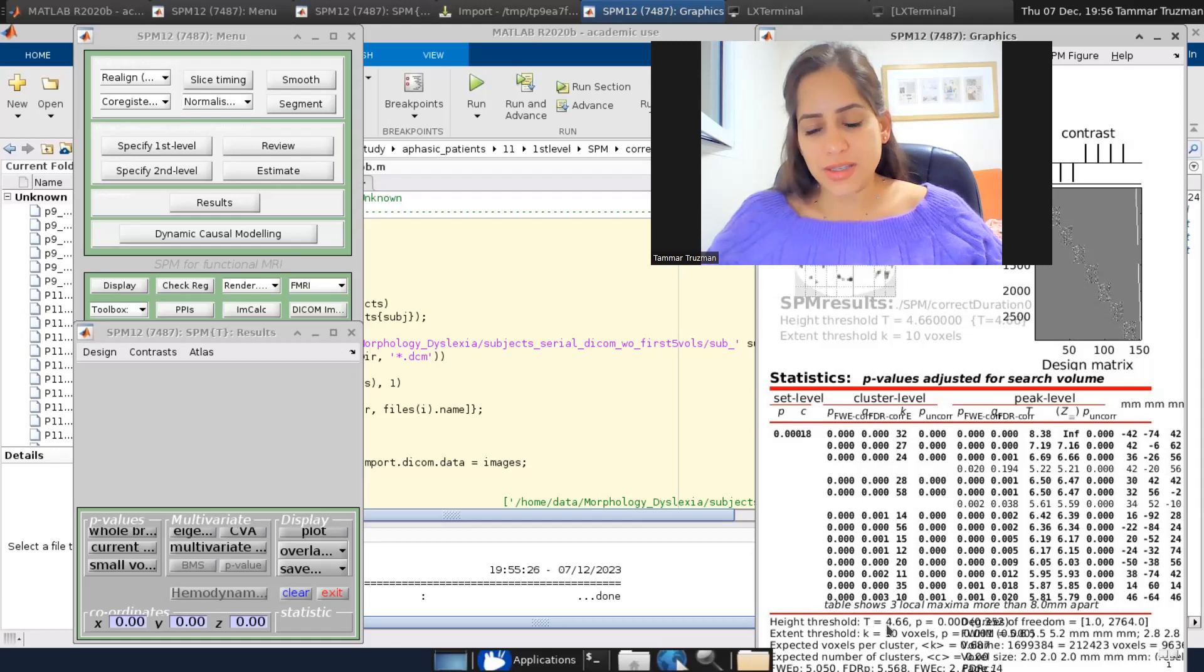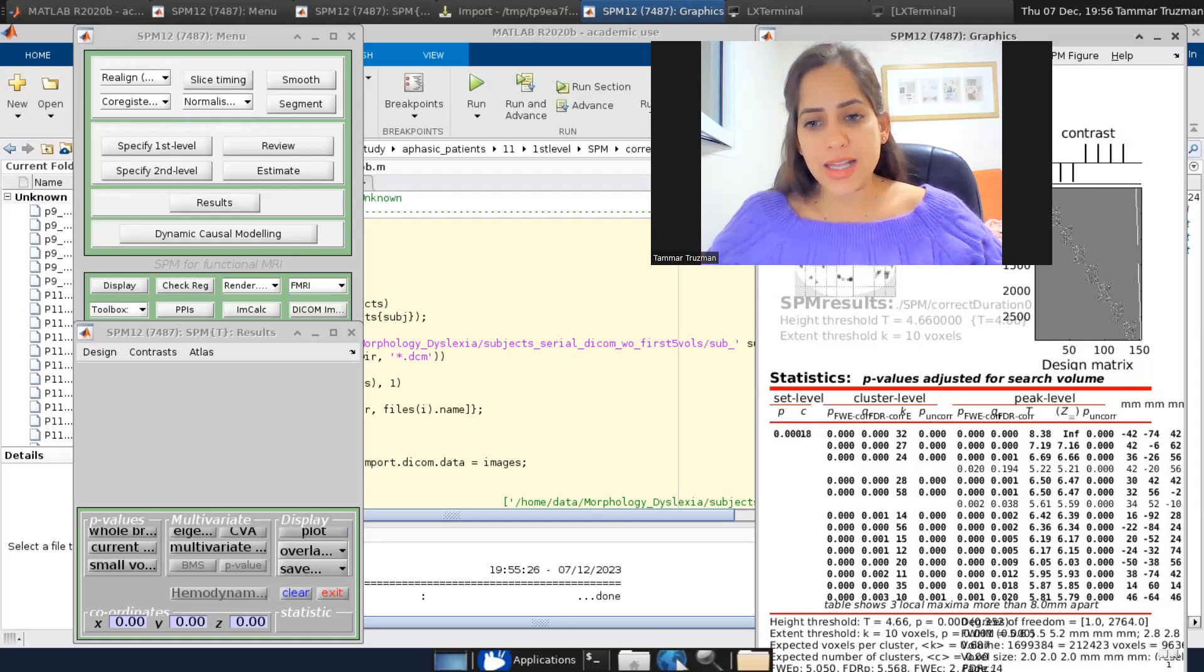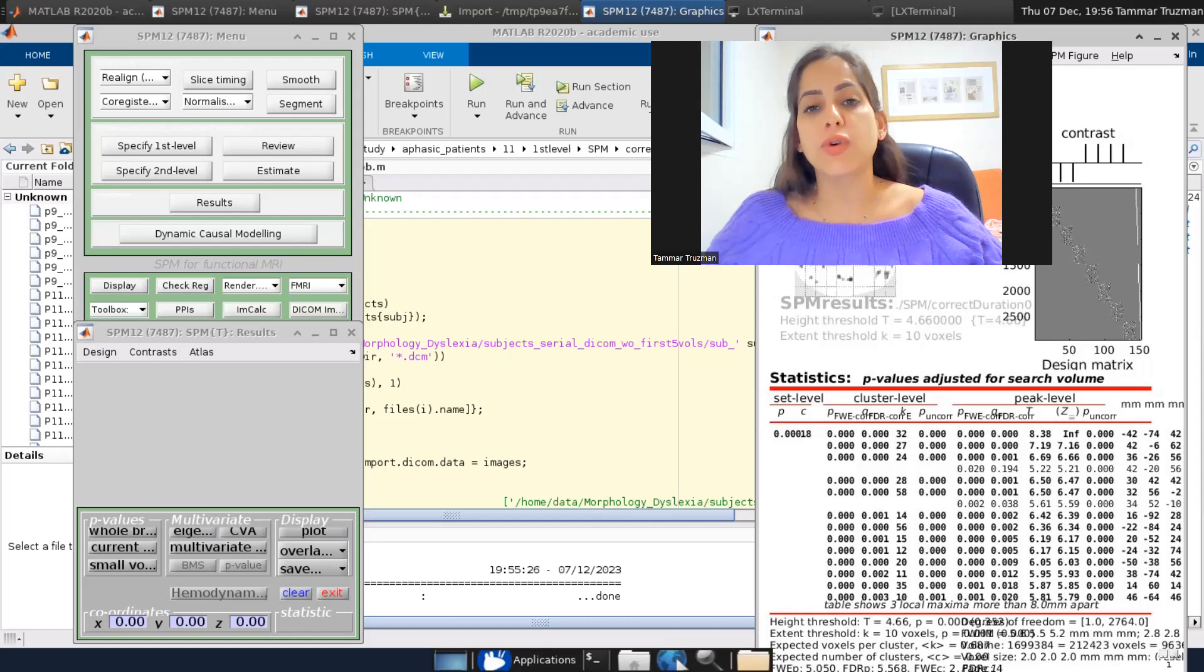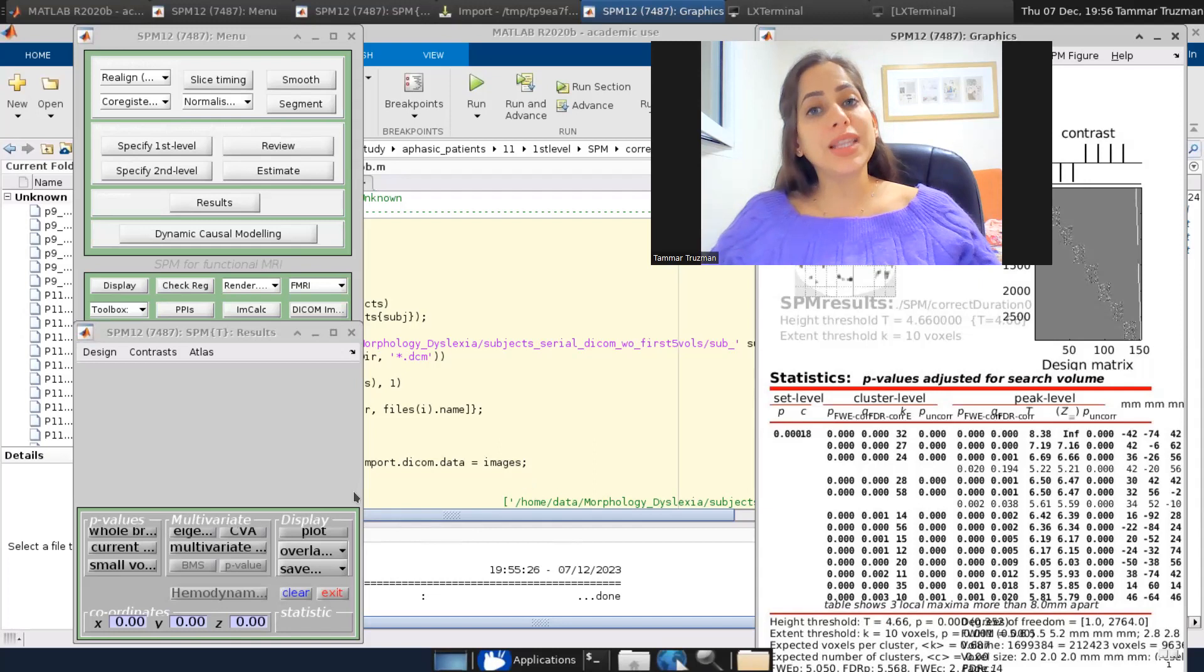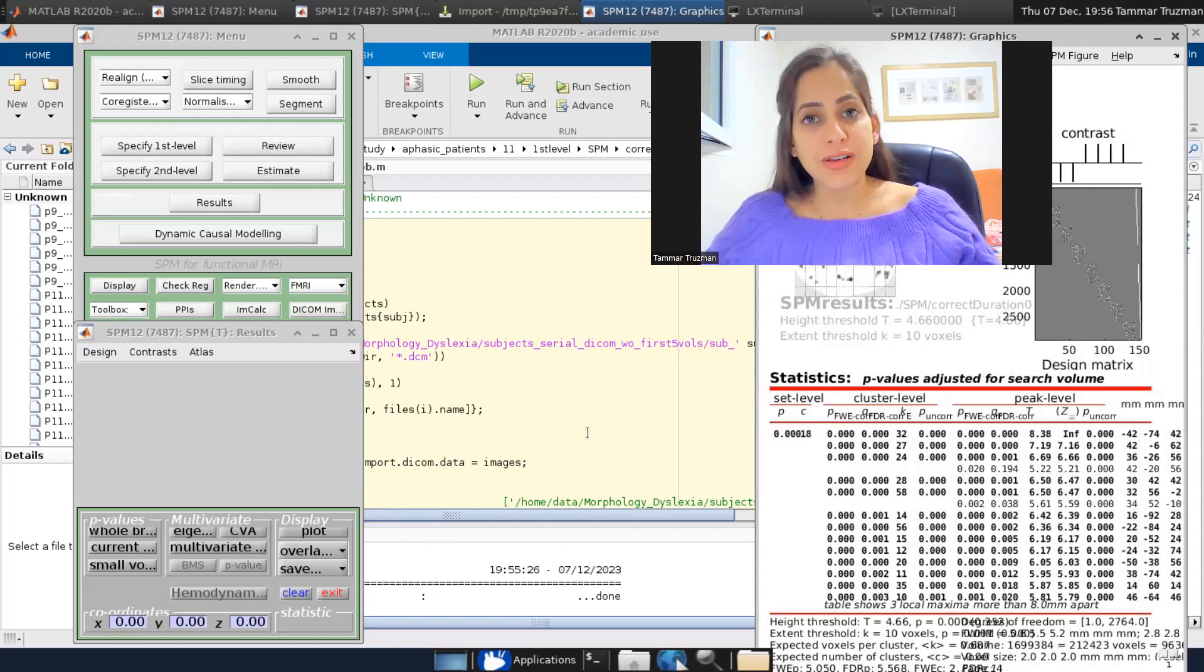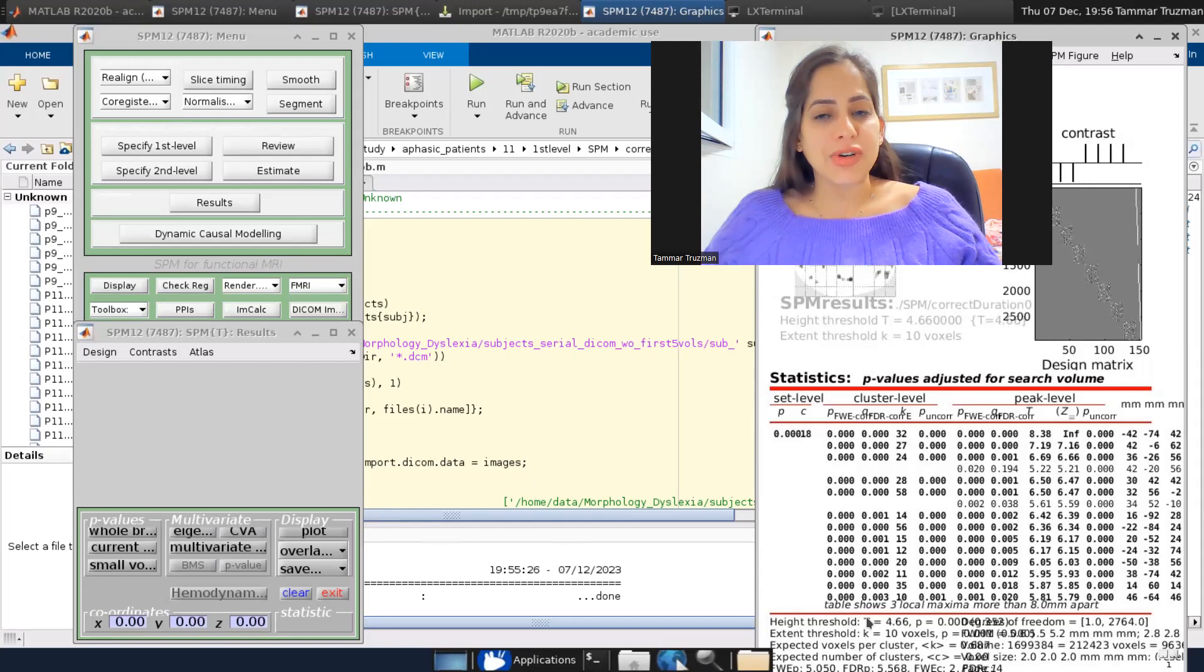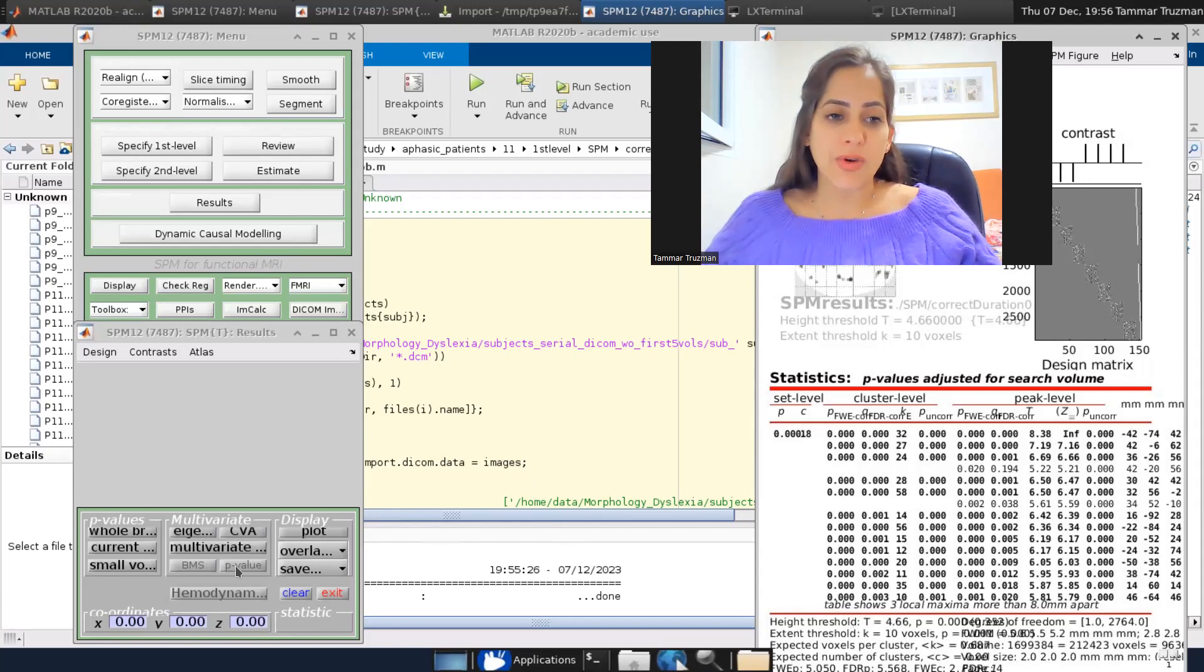So yes, you can see this is my threshold. And again, this is the threshold if I would want to correct for all the voxels within the brain.